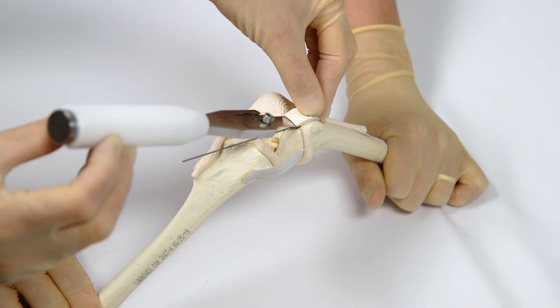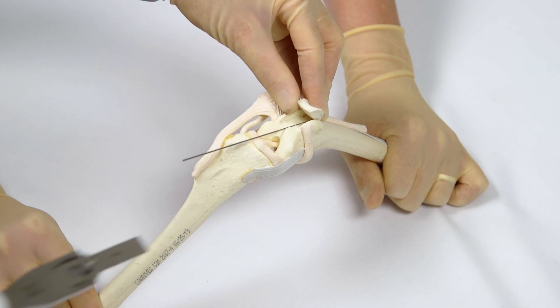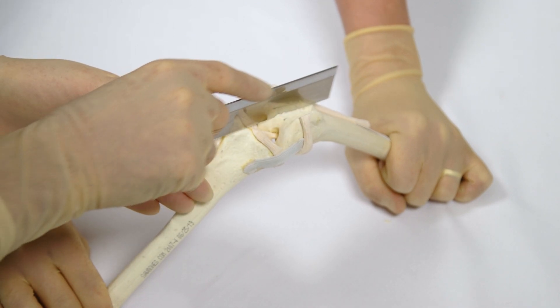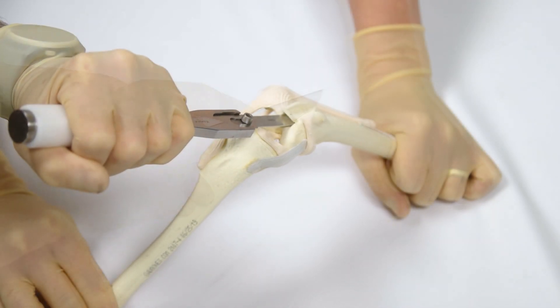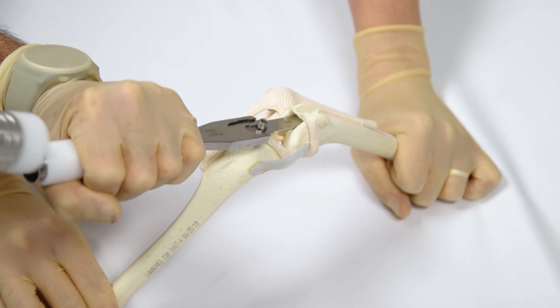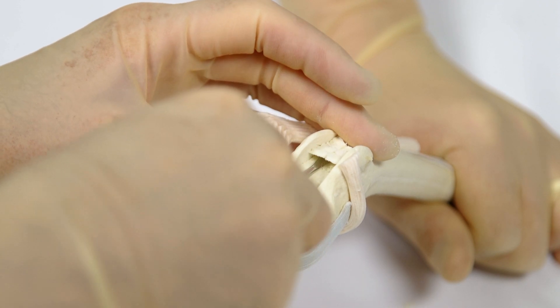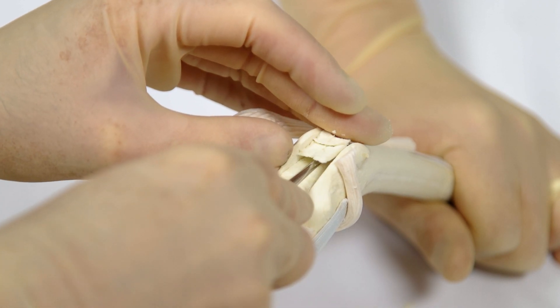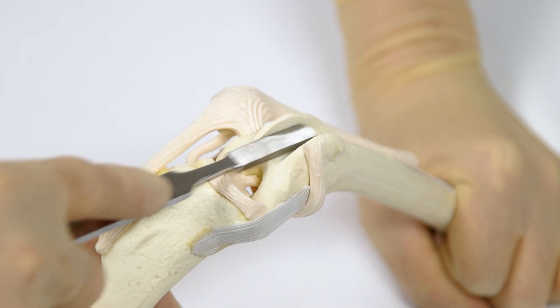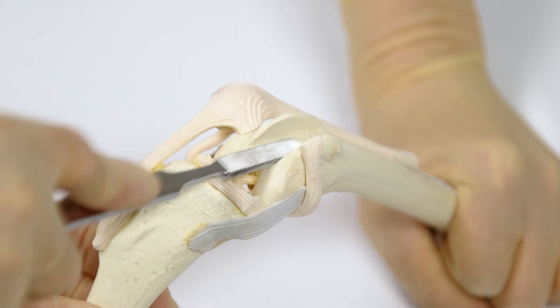Once the osteotomy is complete, the osteochondral block is carefully removed from the femur. Recessing the block is achieved by either removal of subchondral bone from the base of the block, by removal of exposed subchondral bone from the base of the recess, or a combination of both. The subchondral bone surface must be smooth and flat, so removal is best achieved either with the modular osteotome or a rectangular bone rasp.